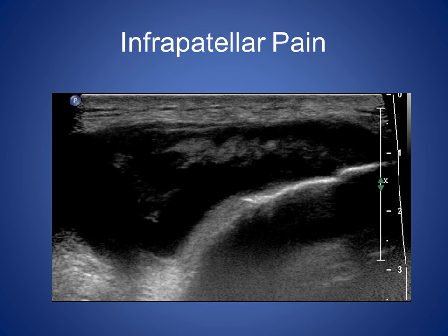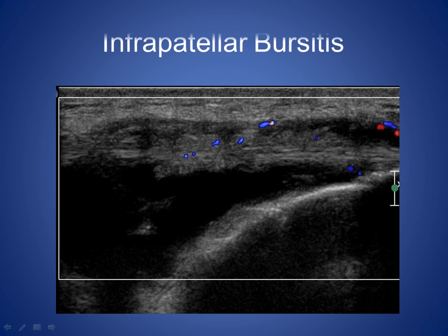Here's a patient with infrapatellar pain, and within the fluid-filled bursa, there's this echogenic material which is hypervascular, and is a typical appearance of infrapatellar bursitis with synovitis.